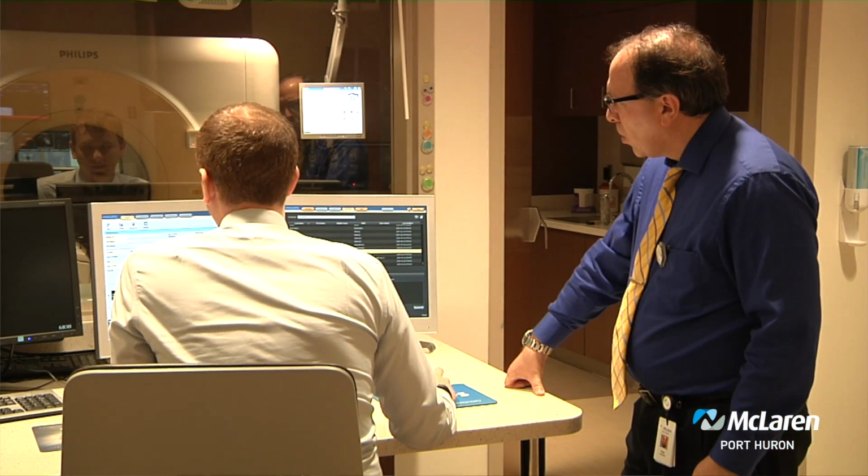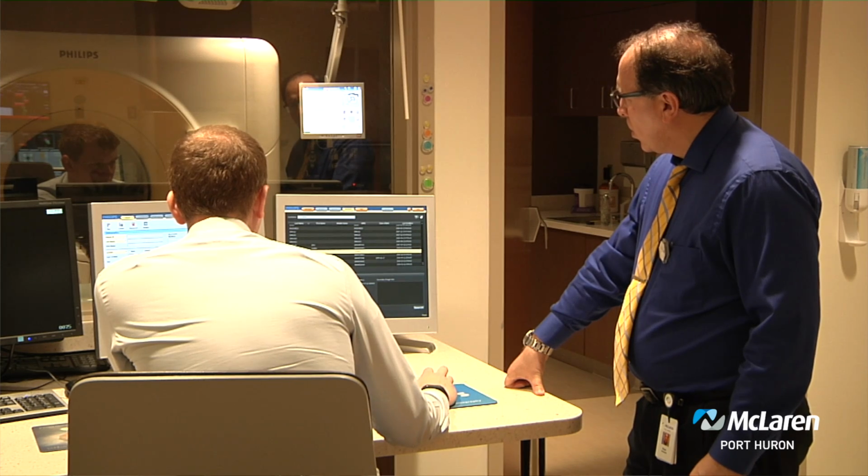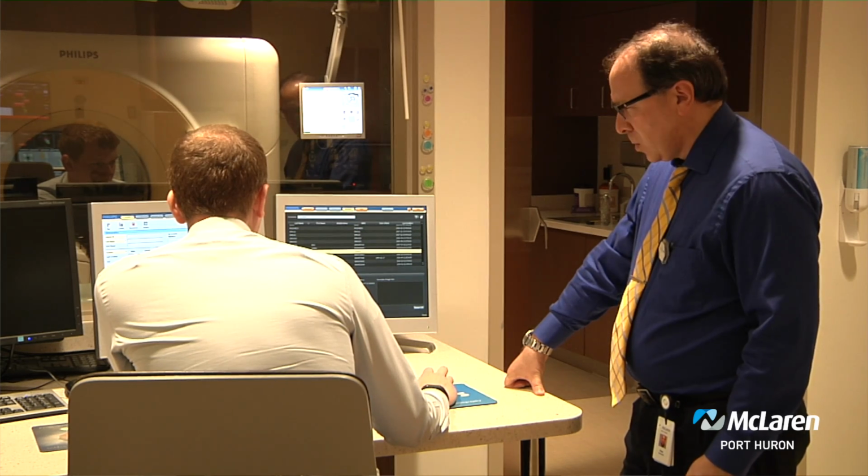So when you were talking about the sim, this is the simulation looking at the tumor. Correct. To map out where you want the radiation to treat and where you don't want it to treat. Correct, exactly. Every single patient that comes in our department will get what's called a CT simulation, and it's basically a CT CAT scan, but it's done for our specific needs in our department. So it really is individual for every single patient, every tumor, everything is different then. Correct. Oh yeah, everyone's unique.